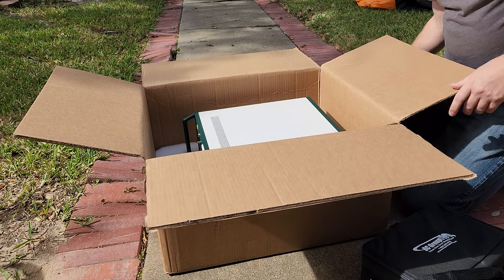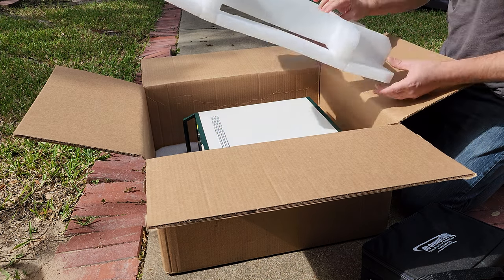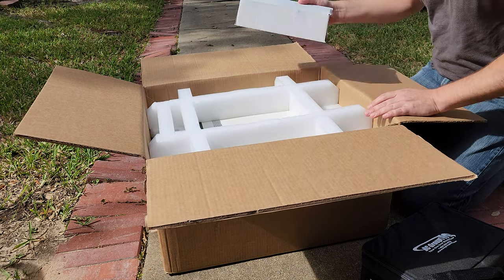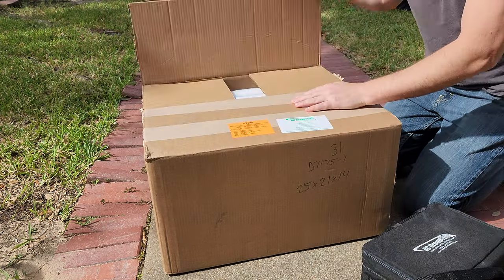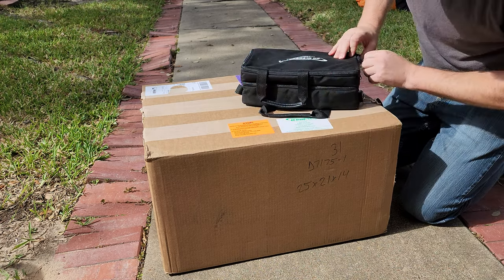I initially cut my teeth on BC Group ESU analyzers years and years ago — them and Fluke were the ones that pretty much the military had for us, so I'm very familiar with those. Now the next question is: what is in the back?